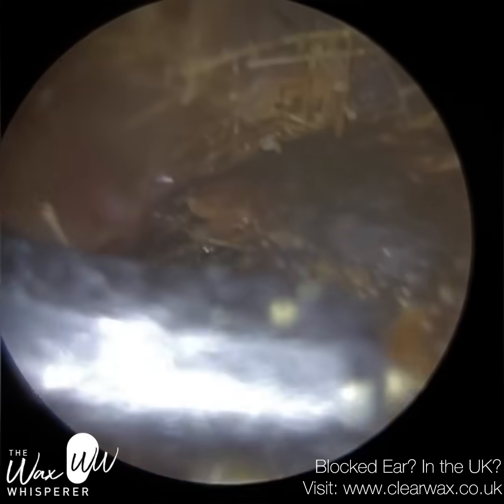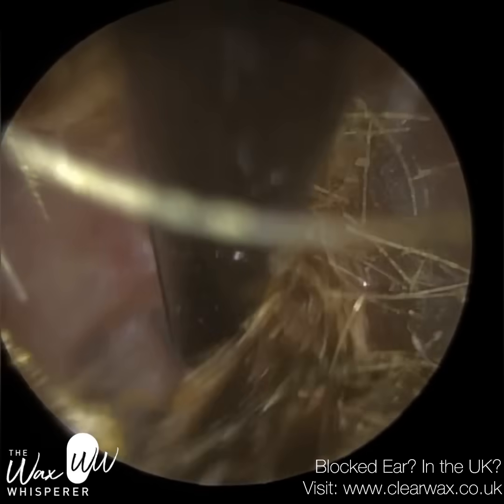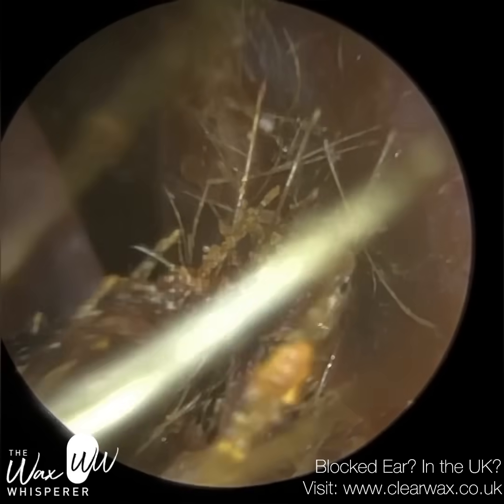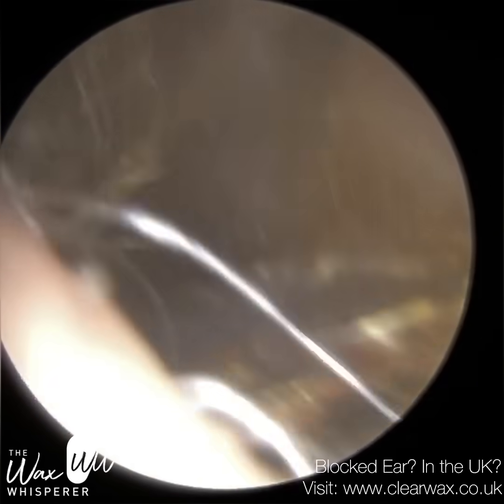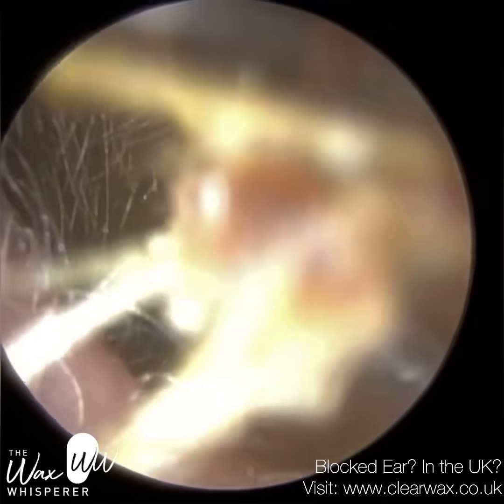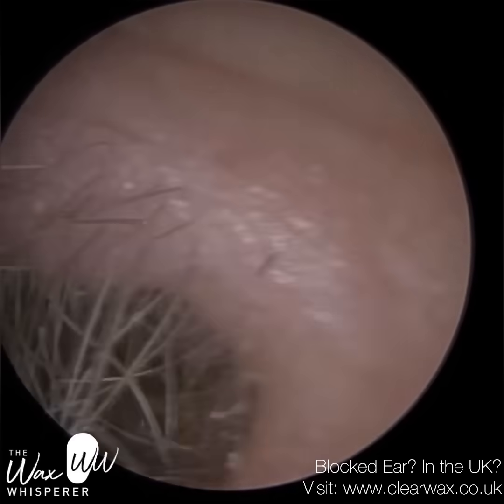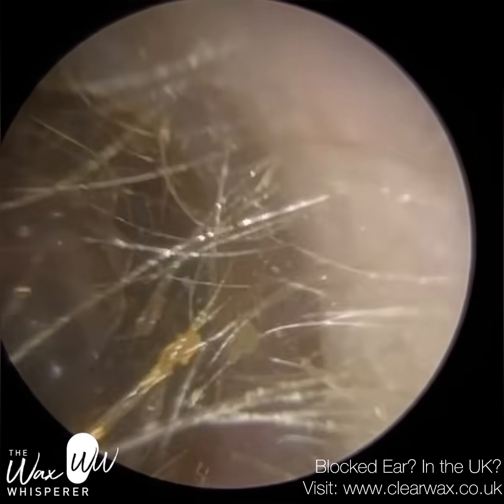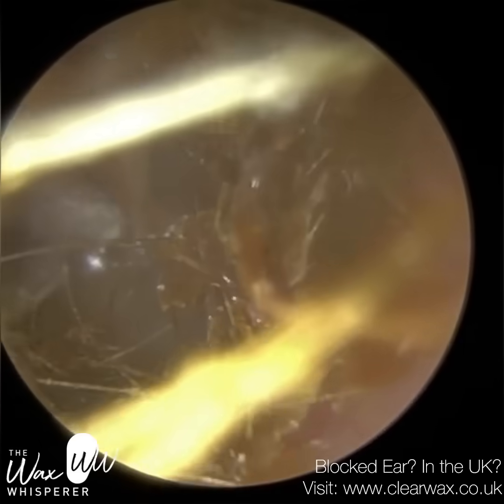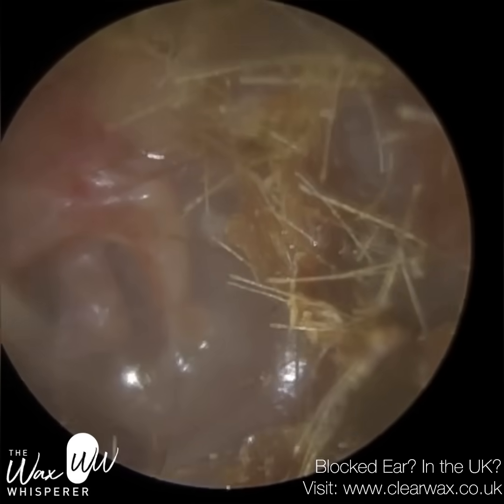And once I remove this dark wax, and also it's a lot of dead skin keratin in the mix here, you will see that this patient has got an extremely retracted posterior, so the back part of their eardrum. And the eardrum is so severely retracted posteriorly that it's draped around the long process of the incus.